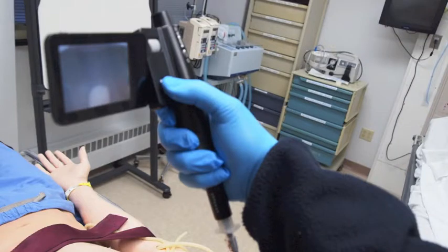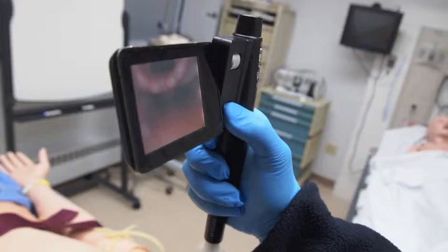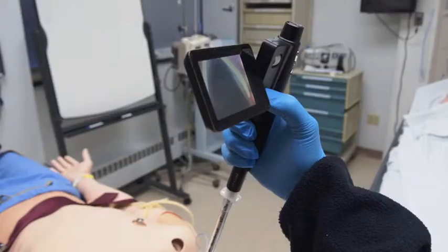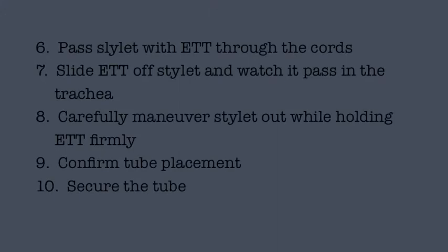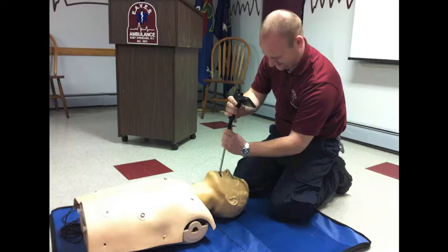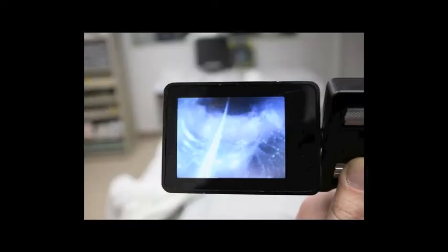You may need to tilt the screen in order to keep the airway in view during this procedure. Please become familiar with this facet of the device. Remember that the procedure is to pass the stylet with the endotracheal tube through the cords. Slide the endotracheal tube through the cords into the trachea and watch the balloon pass the cords. Then inflate the balloon and carefully maneuver the stylet while holding the endotracheal tube firmly. Confirm tube placement with the device and secure the endotracheal tube into place.